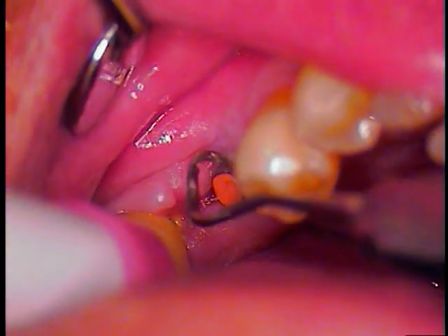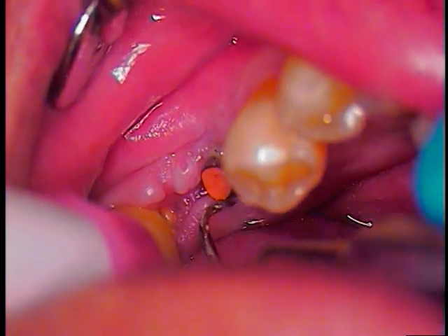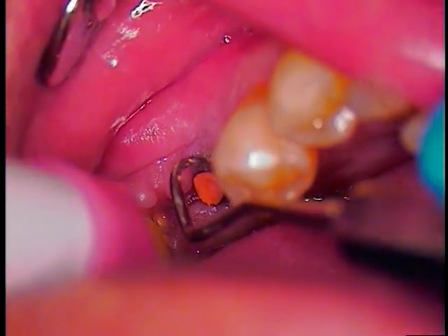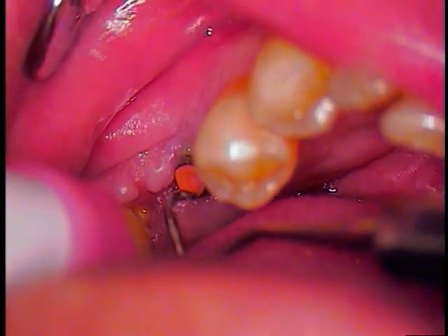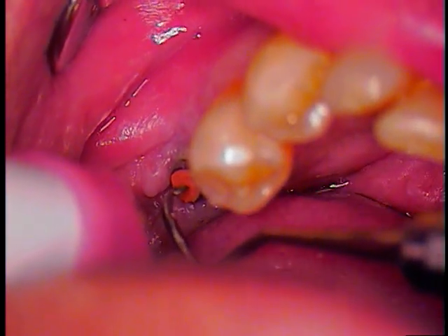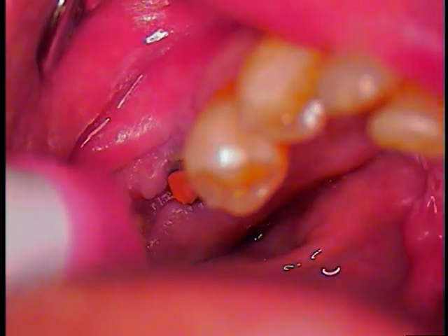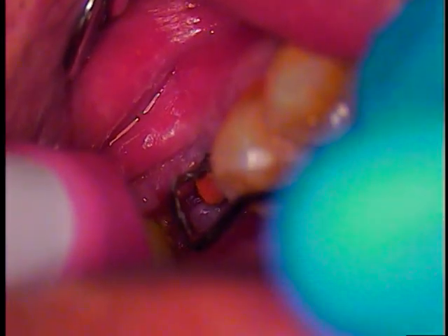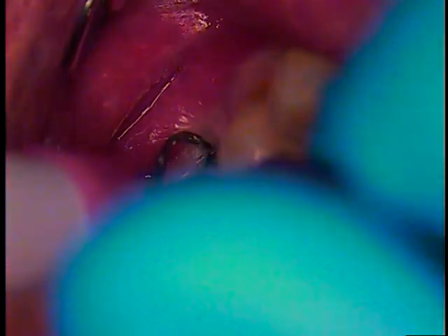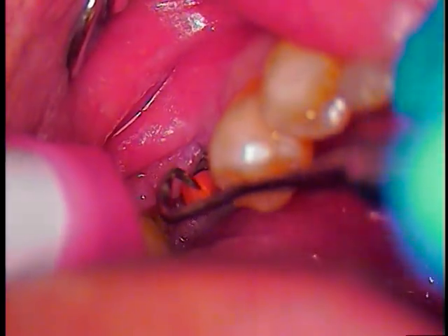We found that this is the conical abutment — there was a prior attempt. This is showing movement today, different from last time. We've got to find out: is it the movement of the fixture or is it the movement of the abutment? If it's the movement of the entire fixture, then it's going to be a very short visit today and we're going to have to refer him to have the fixture removed completely. There is some pus and exudate coming up from the gum line. Our hope is that it's just the abutment. Here's our rubber gasket.